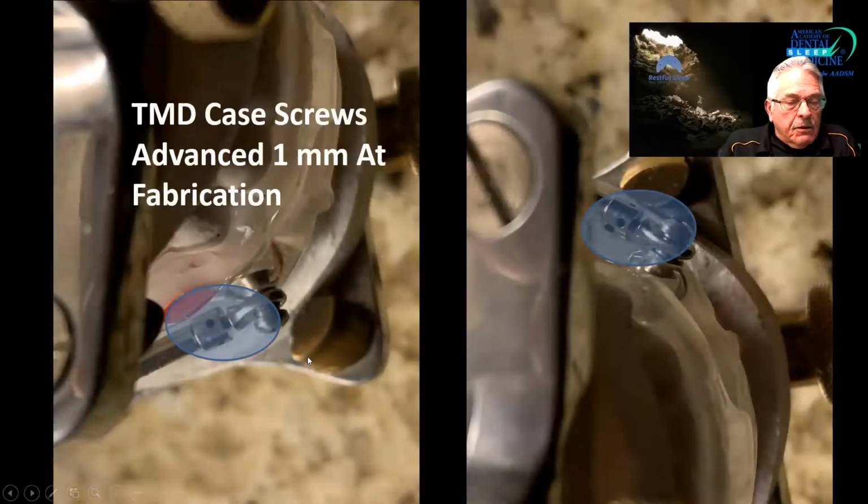This particular case here is a TMJ patient. She's wearing CPAP. She came to me for an oral appliance, had been off her CPAP for 2 months. I got her back on her CPAP. She's wearing that, and then she reached back out to me. She wanted to replace her night guard, which she was wearing without her CPAP, which is a whole different conversation. She wanted now a sleep appliance.